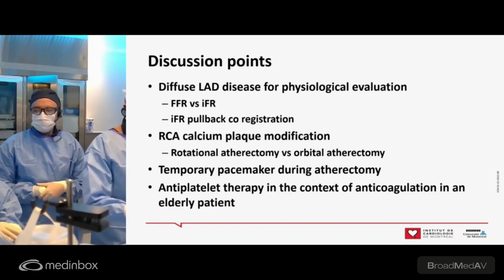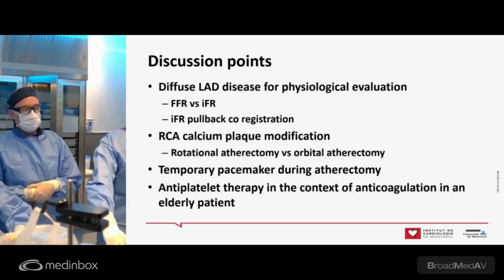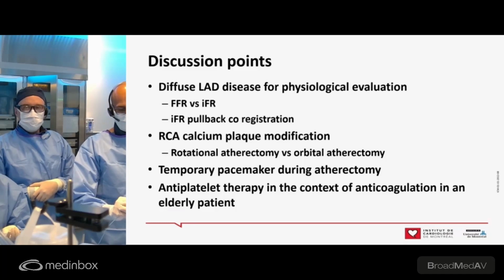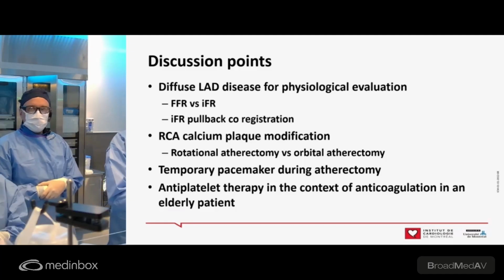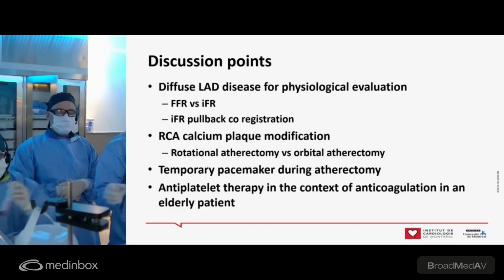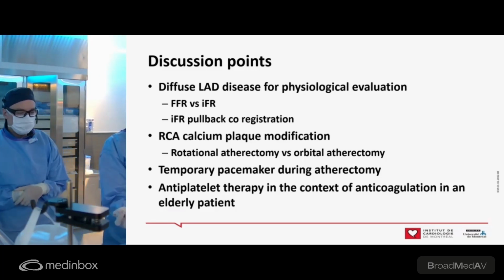We have access, we're very, very lucky here. We have access to rotational atherectomy, orbital, laser, and also IVL. In this case, we debated whether we would use rotational atherectomy or orbital atherectomy. So the pros and cons of each of the strategies: rotational atherectomy is the one we definitely have the most experience with. We've been using it for decades now.